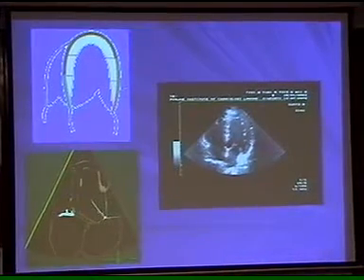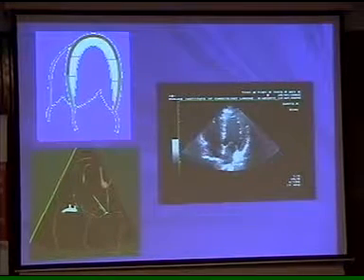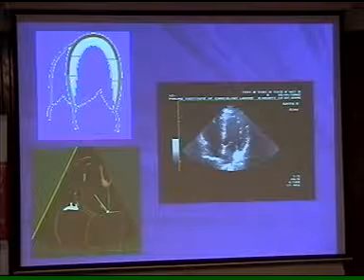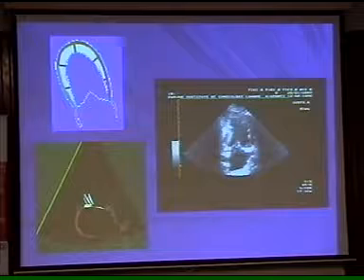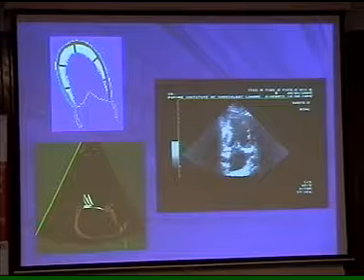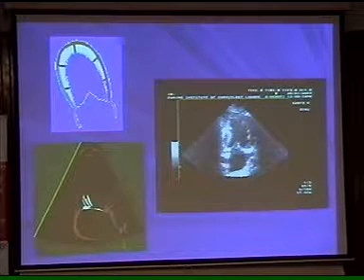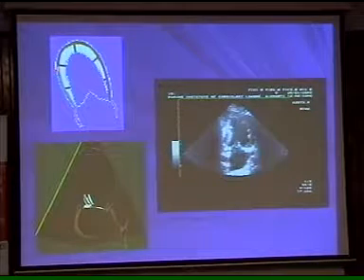Same things are being repeated, going for apical 4-chamber view. This is inferior septum, and this is anterolateral wall, or you may call it lateral wall. So this is circumflex territory, LAD territory, and RCA. This is 2-chamber anterior wall and inferior wall. So we scan it from different angles and reconfirm the same segment from the other region, so that we should be very, very sure that this region is affected and there is no false wall motion abnormality. So this is LAD territory, this is RCA.